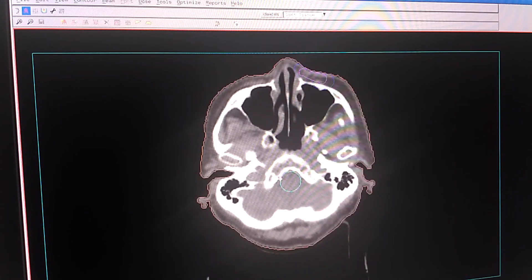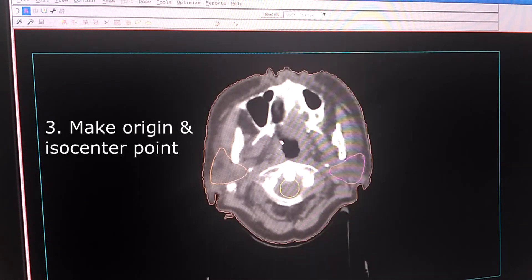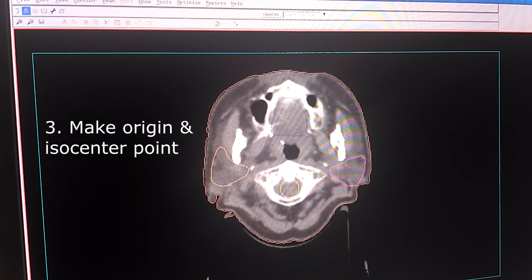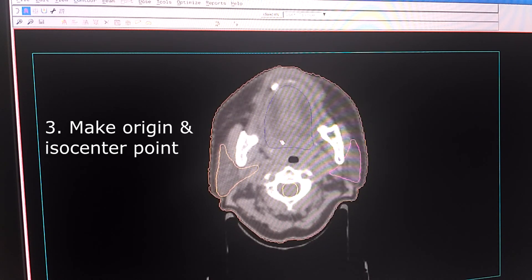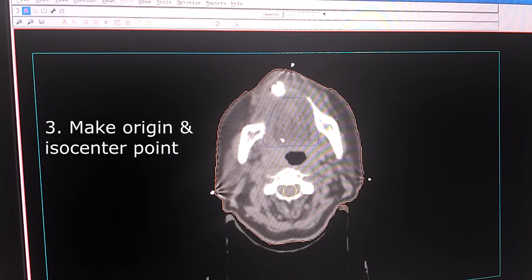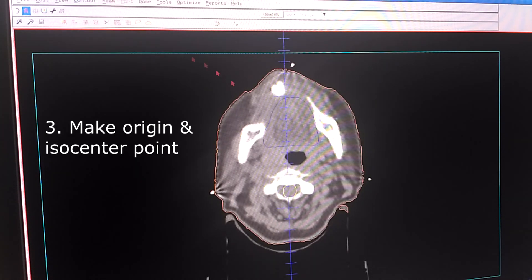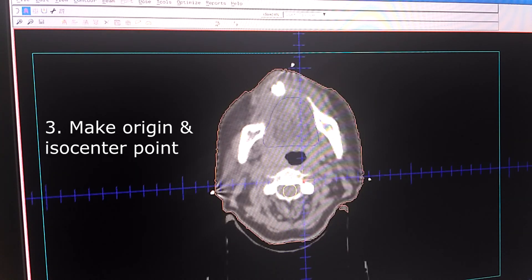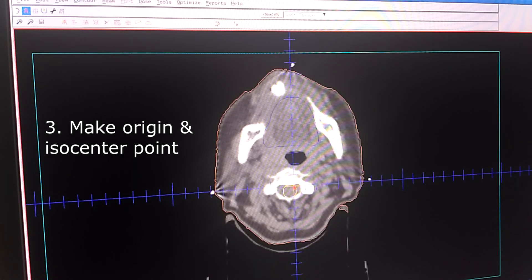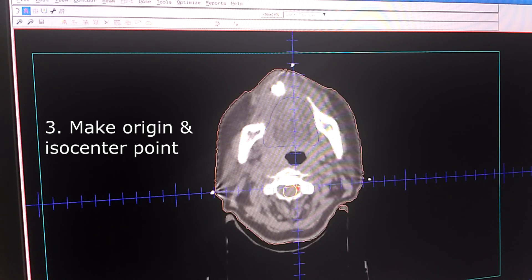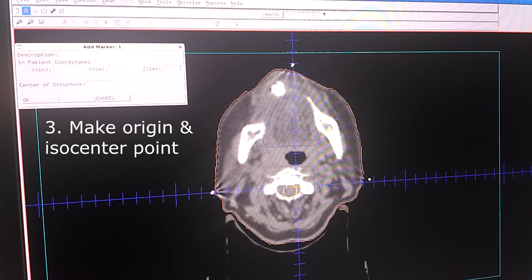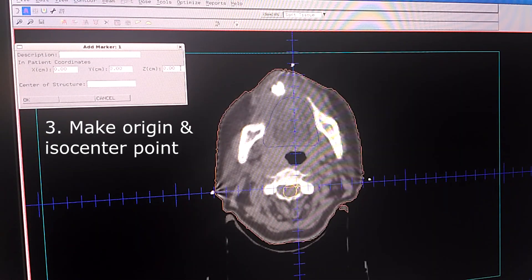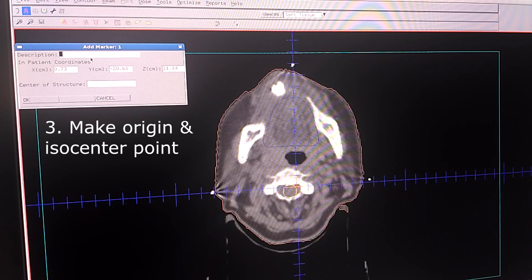The first step is I am going to make an origin point, which is located by RTT used during CT planning. I am going to show the scale, moving it to find the origin point. It is here. And make the point. Click here and let's make it into origin.